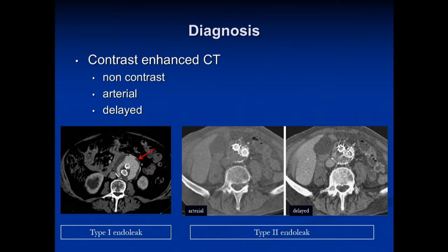For diagnosis, typically we start with a contrast-enhanced CT scan. It's important to do a non-contrast scan, an arterial scan, and a delayed scan. Here on the left you can see a type 1 endoleak on the arterial phase. The two images on the right show no contrast in the arterial phase, but then on the delayed imaging you can appreciate a type 2 endoleak.